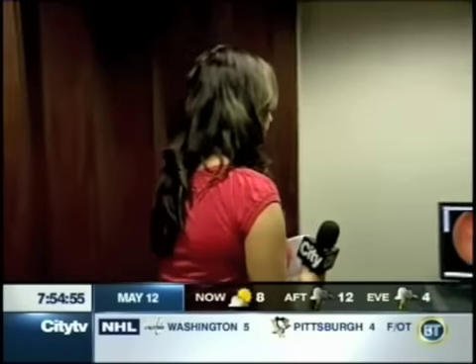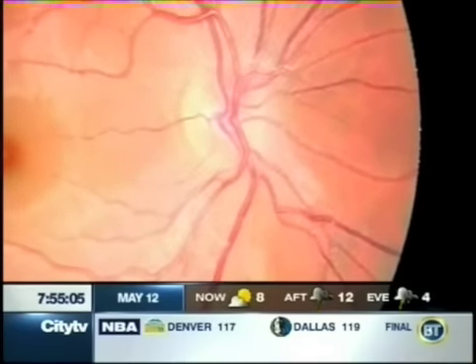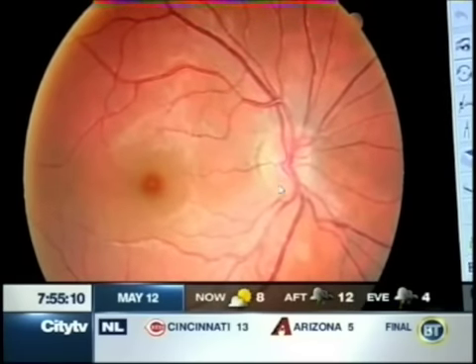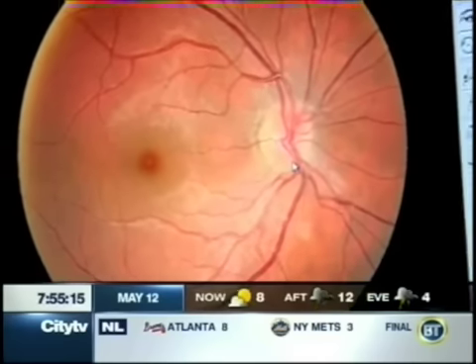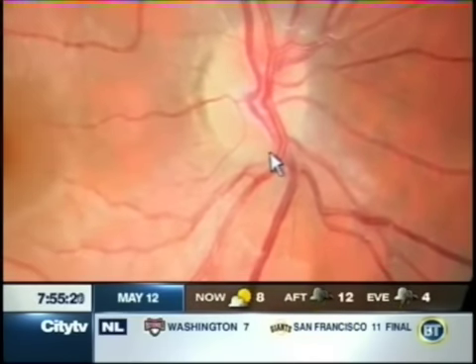Perfect. So then what we do is Dr. Osiowy is going to tell us what exactly we're going to be seeing here, so that we have an actual picture of my eye. So you can actually determine and pinpoint different health problems based on this procedure right here. Is that right? That's correct. So this is your eye. This is your optic nerve, which is a bundle of all the nerve information collecting all the visual input from the rest of the retina. Down the center of the optic nerve is where the blood vessels come in, bringing the blood flow into the back of the eye. So the blood vessels are a continuation of the rest of the body's vascular system. So we are able to assess if there's problems with blood pressure and cholesterol, diabetes.